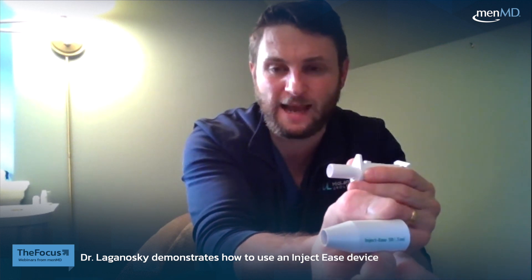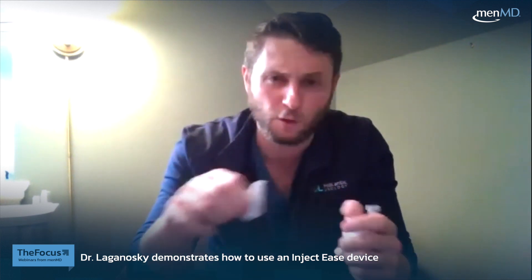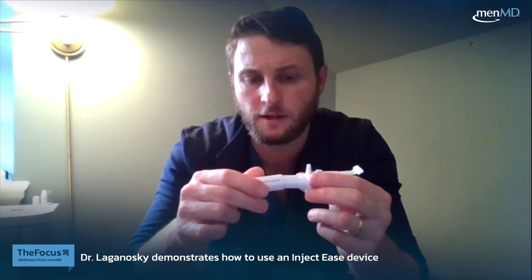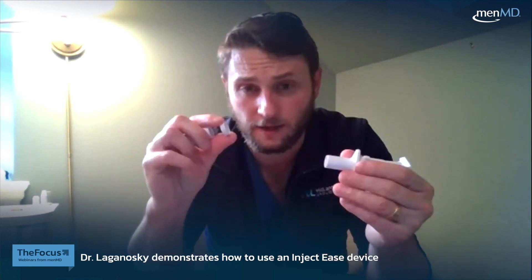There's a cap component here, and there are three different caps that come with it depending on the type of syringe you have. We have a standard 50-unit syringe, so we'll use the one that says 50. There's also a 100-unit and a 30-unit syringe tip. The device also comes with small rings called spacers — you can put a spacer on to minimize how much needle comes out of the tip, and modify that accordingly.